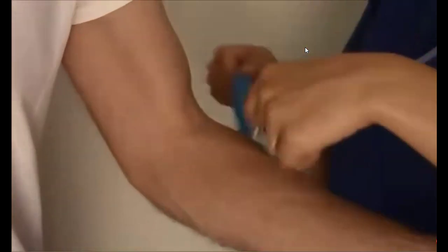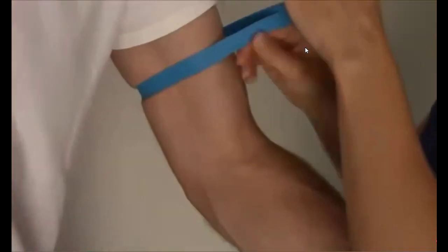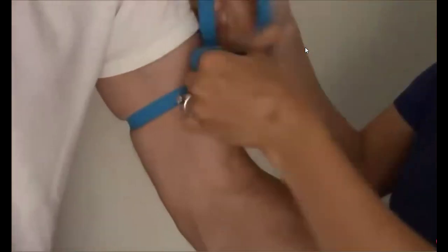So when you put the tourniquet on, tell them what you're doing. You're going to put the tourniquet on. And try to put the tourniquet on tight, but not too tight, and ask them if it's too tight. But you want it tight enough so it makes the blood pool in the lower extremity.